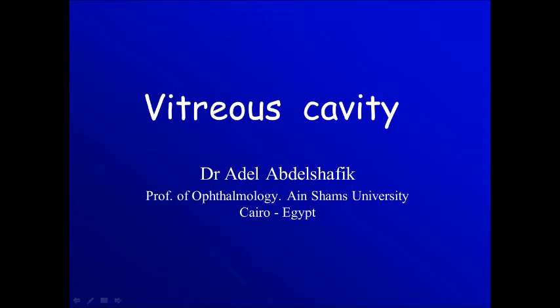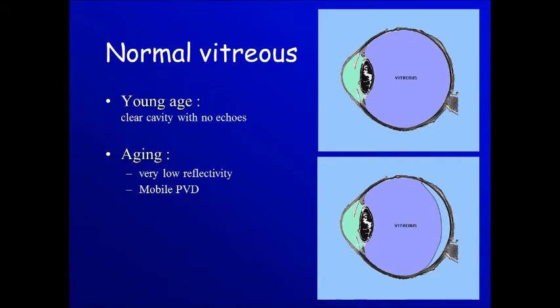In this second part, I'm going to cover the vitreous cavity. Normally in young age, the vitreous cavity is clear with no echoes. While getting older, there is normally a low reflectability in the vitreous, and sometimes we have a posterior vitreous detachment which is mobile.